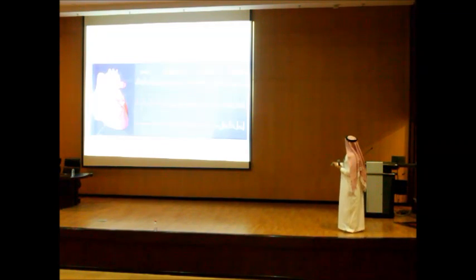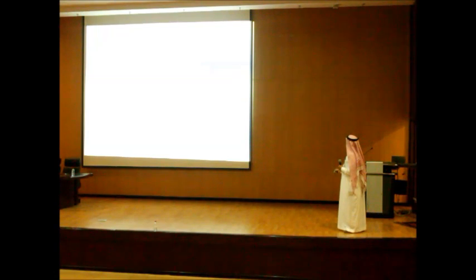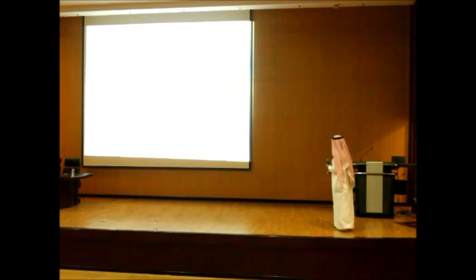Okay, so this patient has this lateral infarction. There is elevation in lead 1, and V5, V4, V6. Okay, so what is this? This is the last slide.